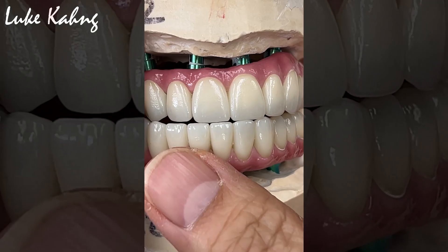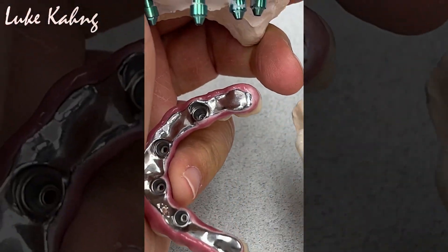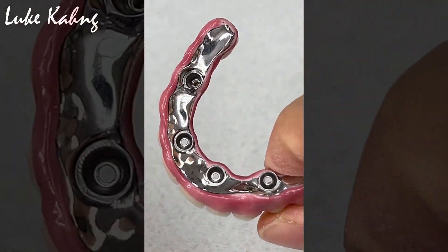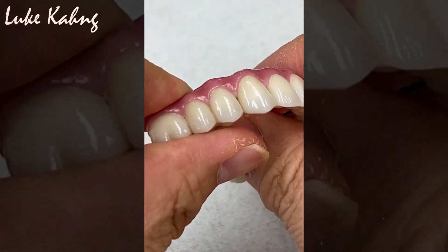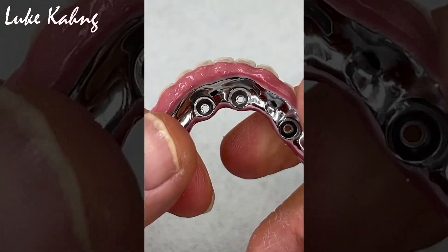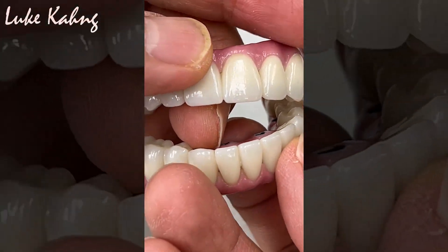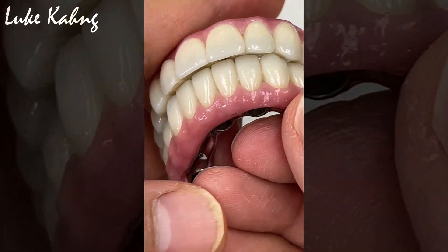This is the final after cementing, both top and bottom — so it's on screw now. Never had any problems — the base is filling out, and we're trying to make it as thin as possible. It's all monolithic, so we protect it really well. So this is cool — KC Sighton 7 Star, we just finished it. The final restorations — a very unique case.